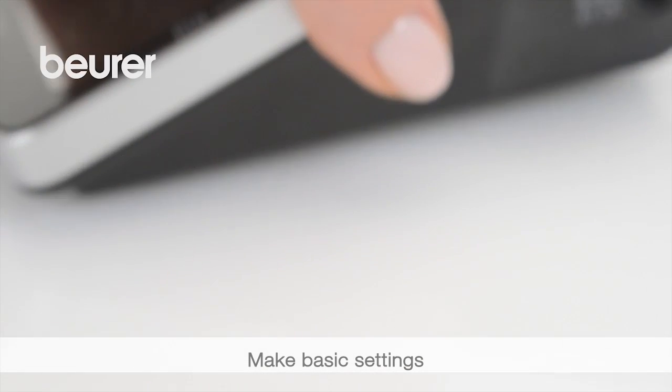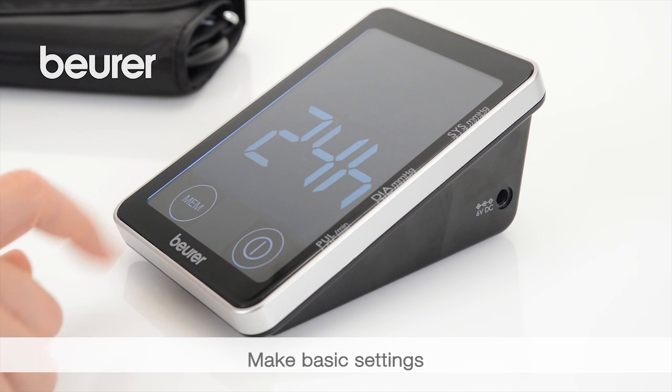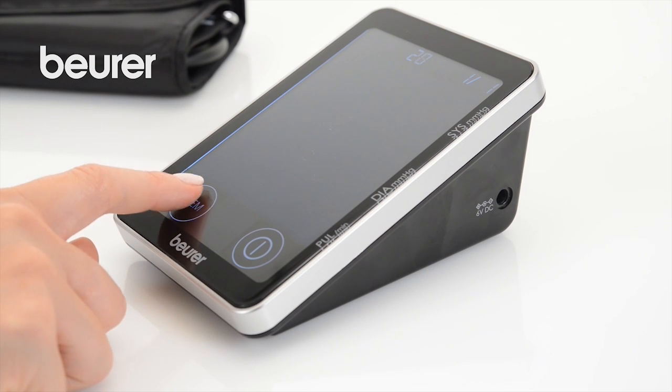To do so, press the start stop and MEM button simultaneously. The year display will start to flash. Press MEM to set the year, then press start stop to confirm.